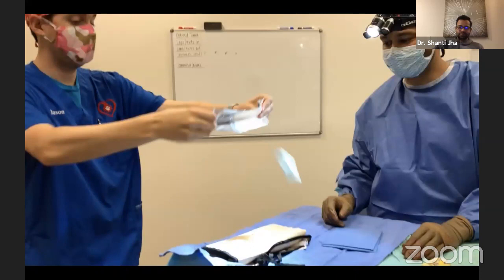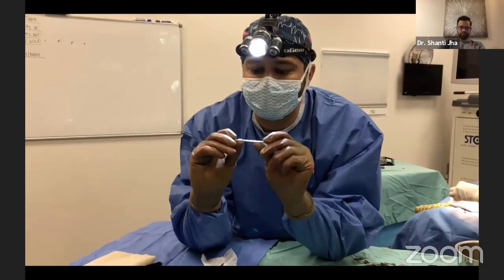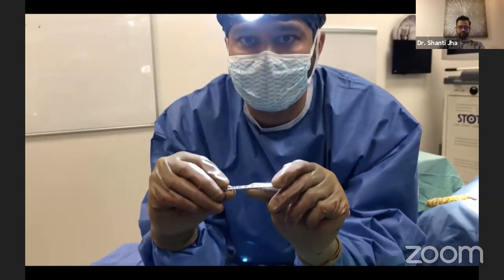Here is again a 2.0 small plate. Pre-stressing: the fracture is right here, and I'm going to bend it like that. Just a 1 or 2 degree bend right here, and then we'll slap this plate on the bone, and it will get both the cis and trans cortex properly.